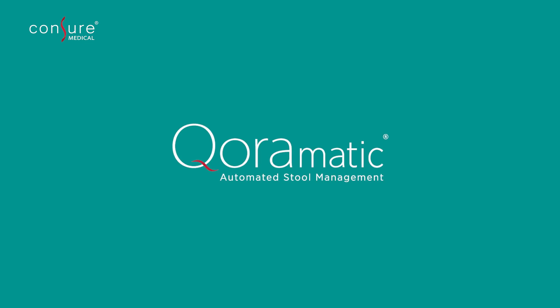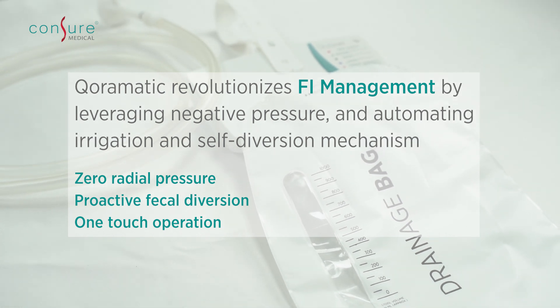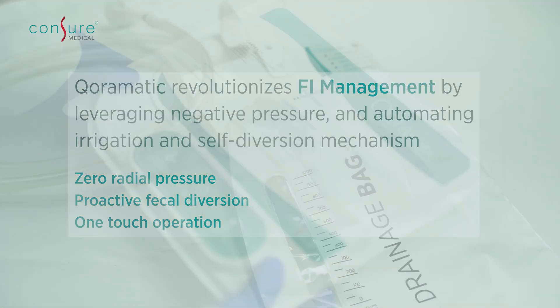Introducing Coromatic, the industry's first-ever automated stool management kit. Coromatic uses negative suction pressure to proactively divert fecal affluence away from the patient.